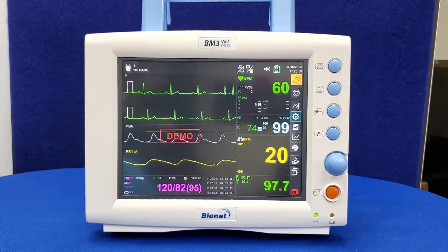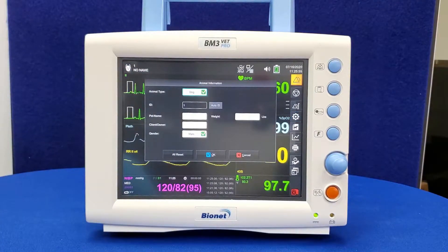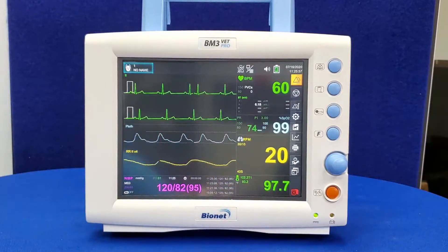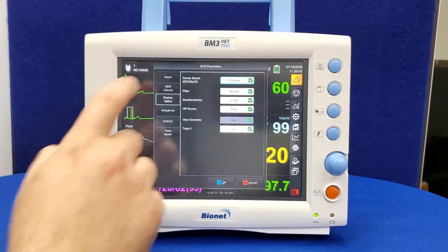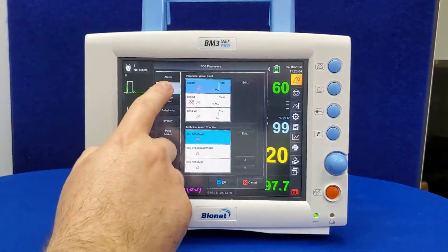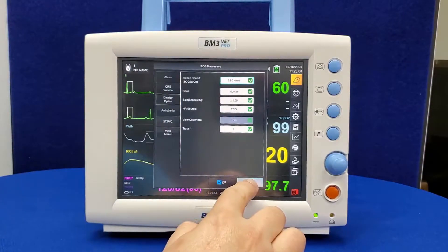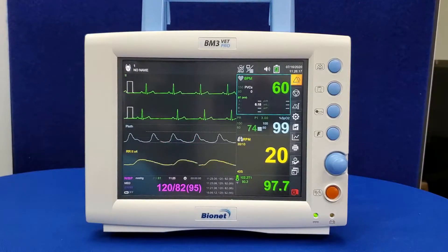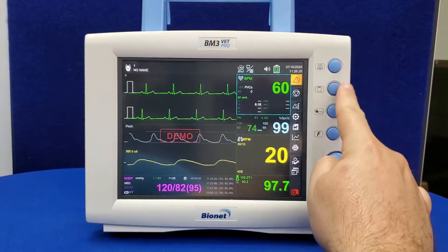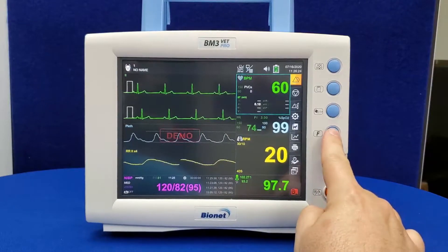Patient information can be loaded by clicking the animal icon on the top left corner. All parameter settings can be adjusted by touching the parameter numerical display. From here, you can adjust alarm settings, QRS volume, and sweep speed. For more in-depth guides to adjusting the settings on your monitor, visit BionetUS.com for further videos and product information. The buttons on the front of your monitor allow you to silence your alarms, print current readings, inflate the blood pressure cuff, and change the display style of your parameters.